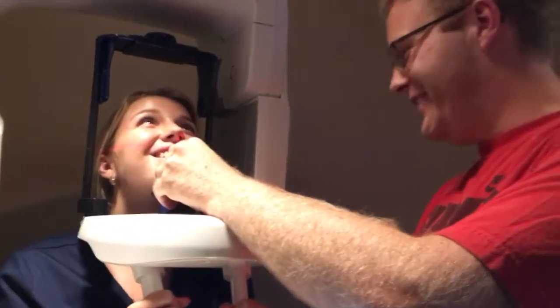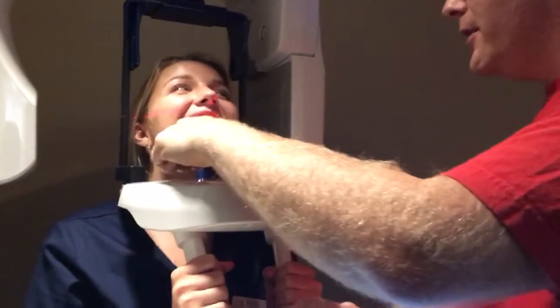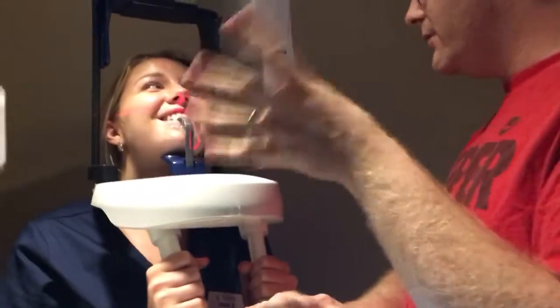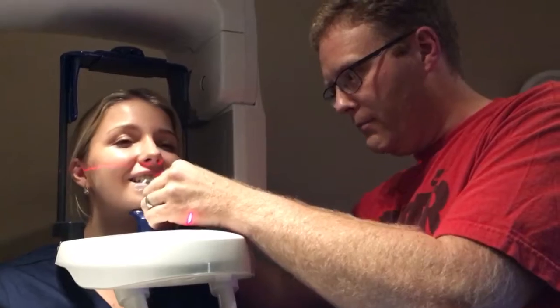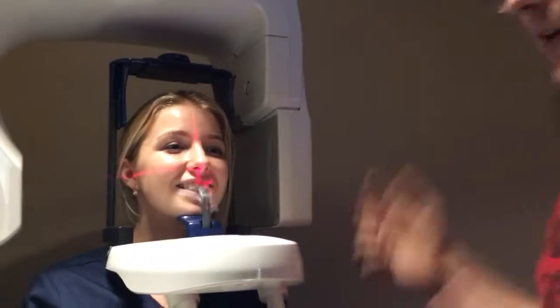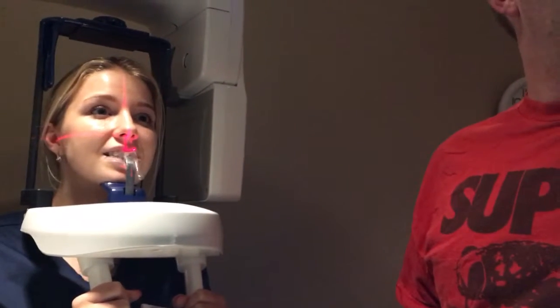My goal is to get the tip of your chin on the rest. I'll lower this just a little and then adjust your position. Lower the stick and have them lift themselves up — you'll be more successful. At the very beginning, if it seems too high, don't even let them get close to the machine yet. Have them stand back, get the machine down to the right height first, then bring them in. Don't start too high.